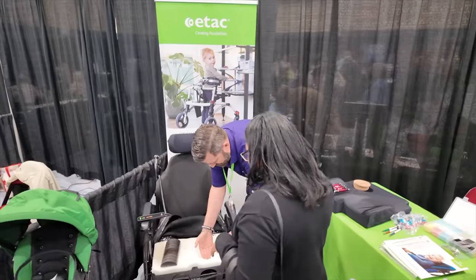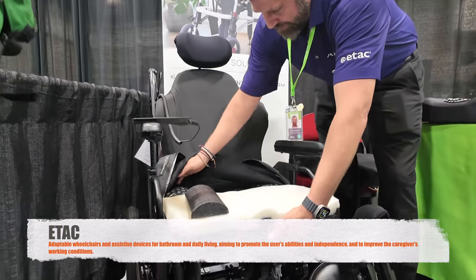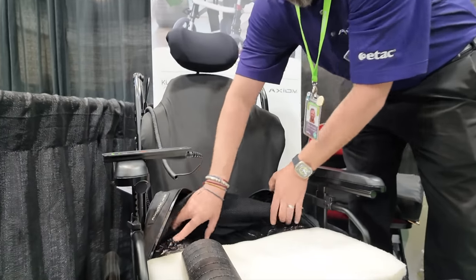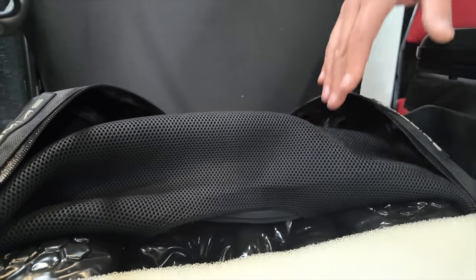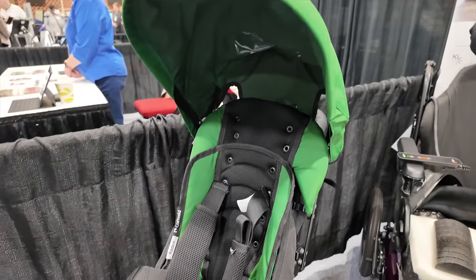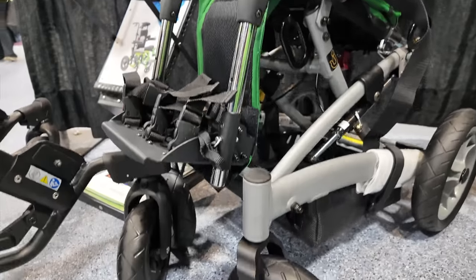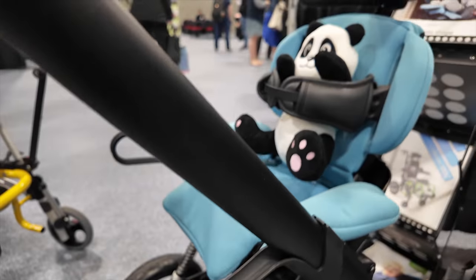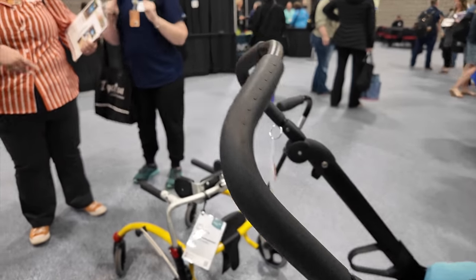It's by medical. So what we ask everybody to do is move all the gel to the back here. The whole purpose is you put your greater trochanters down here and offload your sitting bones right there. While you're offloading your sitting bones, you have to have somebody that has sensation, and they're going to tell you, all right, finally I don't feel my sitting bones anymore. It's because that gel starts to migrate towards the front of these channels. Once they tell you that information, you then, with them still on the chair, shove this in so it prevents any of the gel from leaking further forward. And mom, if the kid gets tired, they can just put the seat down.